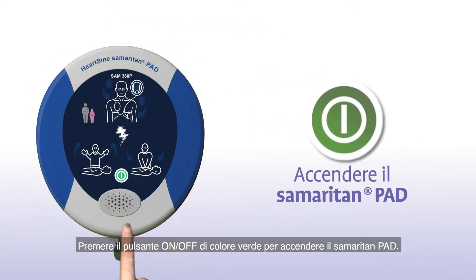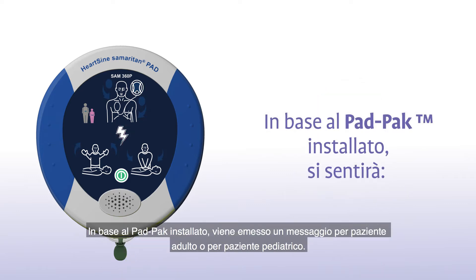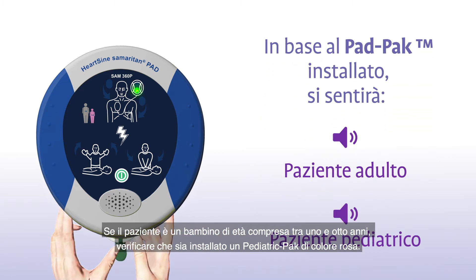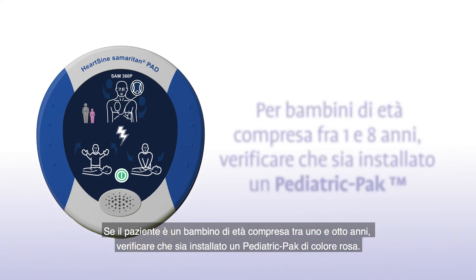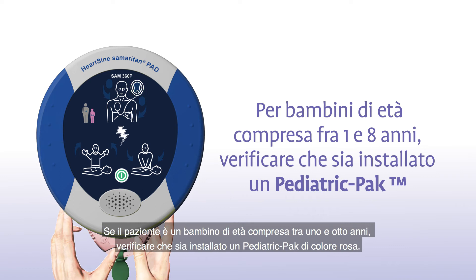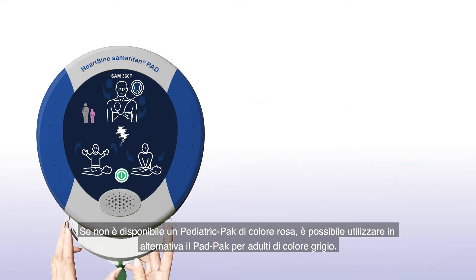Press the green on-off button to turn on the Samaritan PAD. Depending on the pad pack currently installed, you will hear either an adult patient or a child patient prompt. If the patient is a child between 1 and 8 years of age, you should ensure a pink pediatric pack is installed. If a pink pediatric pack is not available, you may use the gray adult pad pack instead.